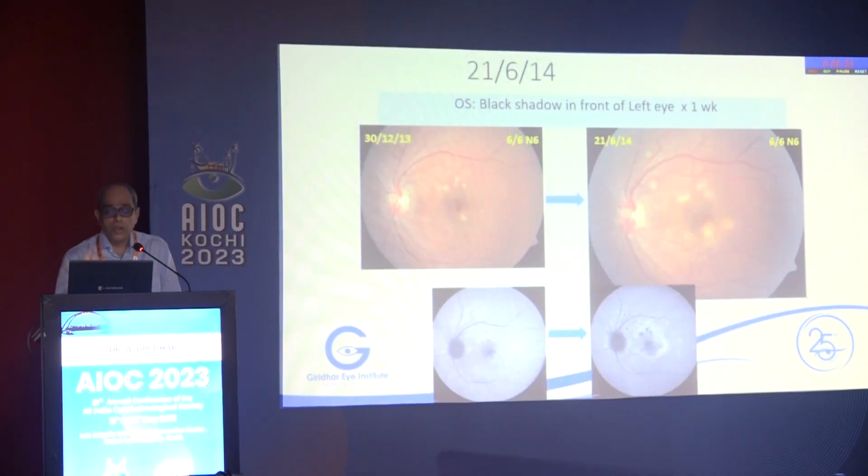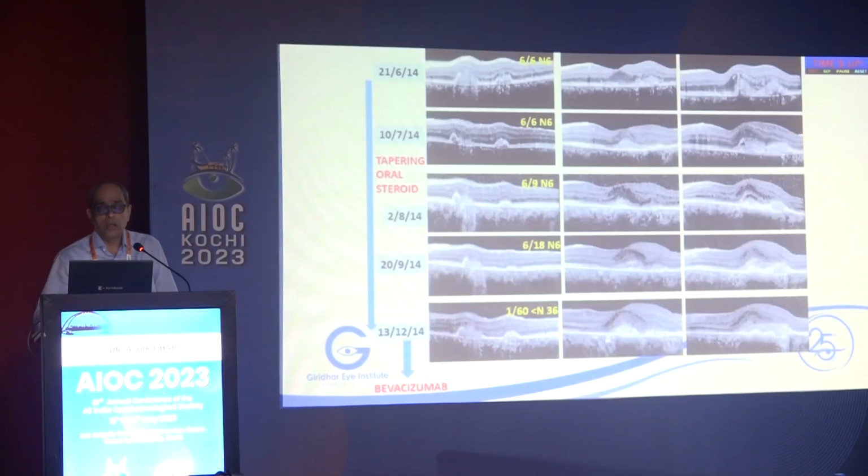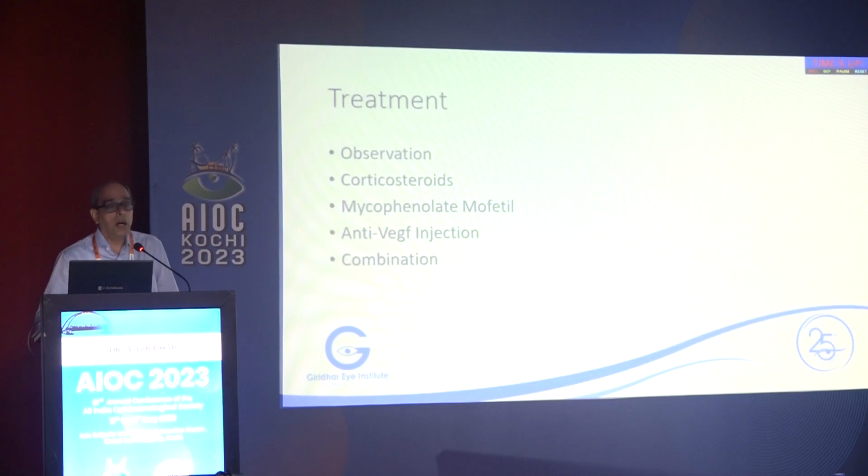In follow-up also, it is very useful to see for recurrence. Now, if you see the left side lower autofluorescence, you see patches of decreased autofluorescence surrounded by hyperautofluorescence. So the presence of hyperautofluorescence, especially in cases like serpiginous choroiditis, the PGI group has beautifully demonstrated how increased autofluorescence is a sign of activity. So in inflammatory disease also, it is a very useful method of application.